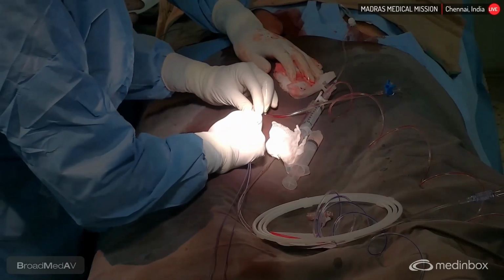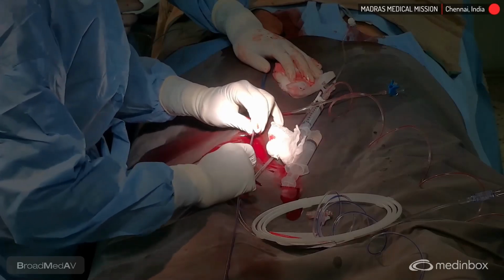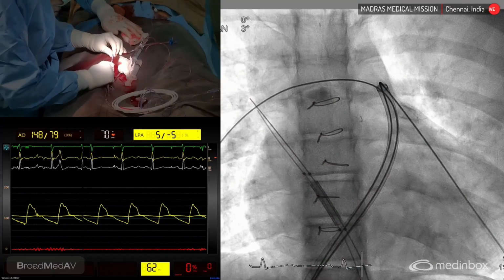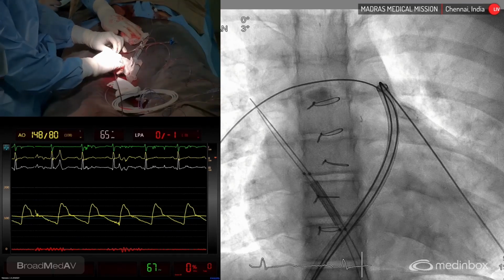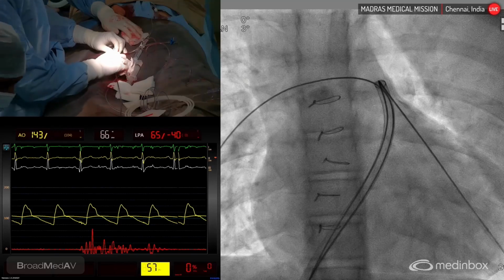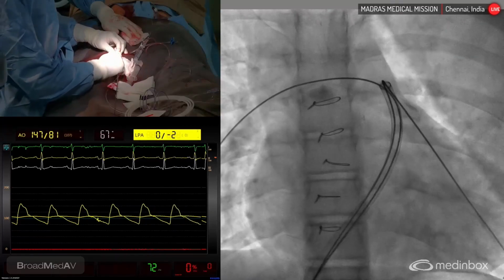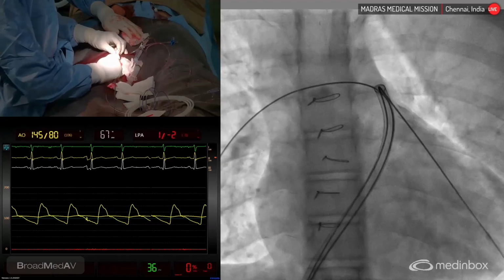So we are advancing both systems through this sleeve. I'm getting both the stents passed deeper. And now I'm withdrawing this sleeve out. So now both the wires you're holding. So now I'm slowly advancing the system without giving any tension on the wires.